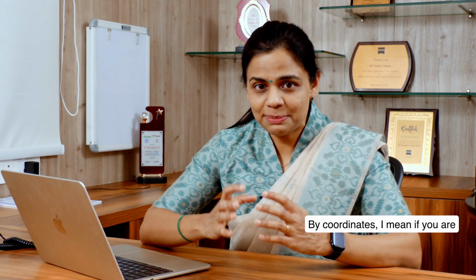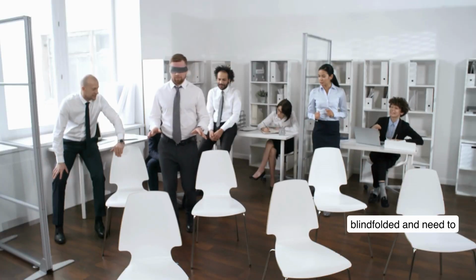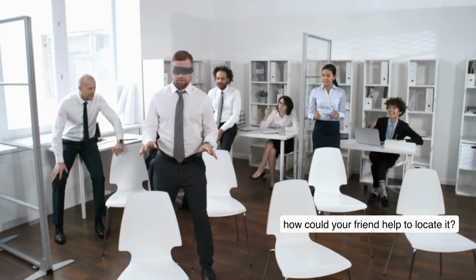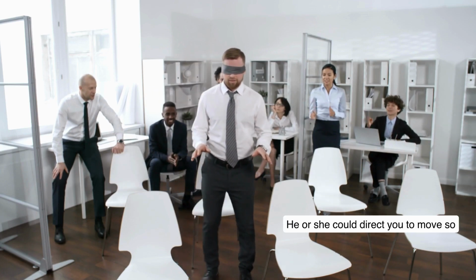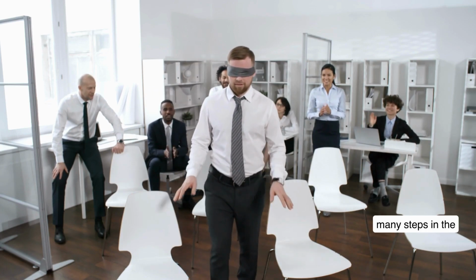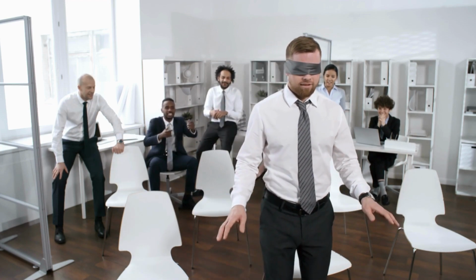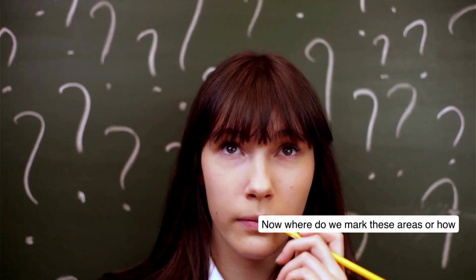By coordinates, I mean if you're blindfolded and need to locate a chair in a room, how could your friend help to locate it? He or she could direct you to move so many steps in the x-axis, then so many steps in the y-axis until you reach the chair. Similarly, the machine is instructed to send or not to send x-rays towards a particular point with reference to a point called the isocenter. Although this is too much of an oversimplified version, I hope this gives you a vague idea.